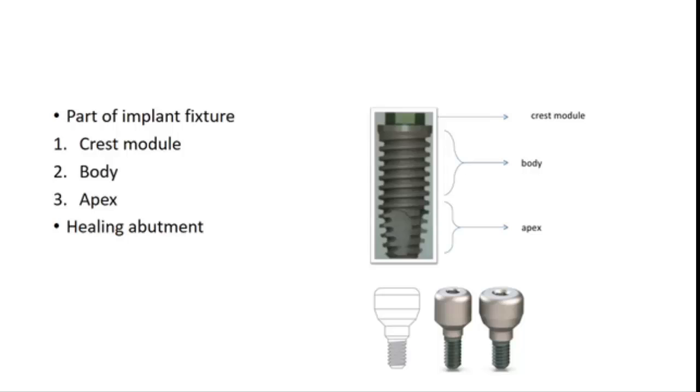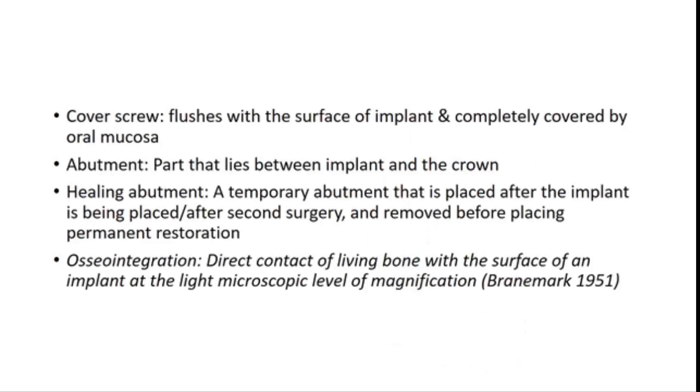And after removing the cover screw, the healing abutment is placed, so you get a good aesthetic emergence of the dental implant. That's called a healing abutment. So again, the same thing is there on the slide which I was explaining to you. The cover screw will be flush with the surface of the implant, completely covered by the oral mucosa.